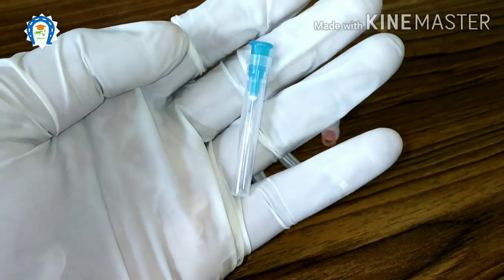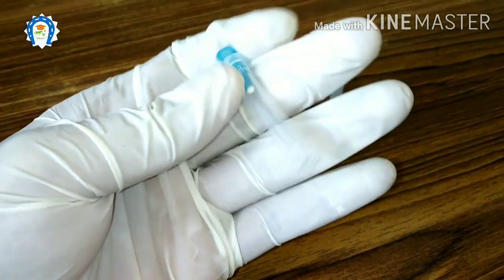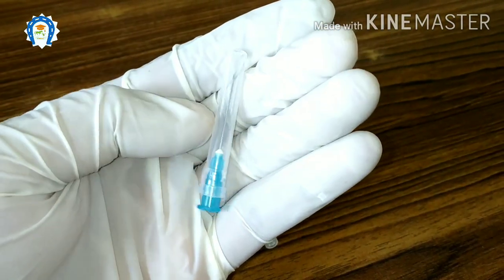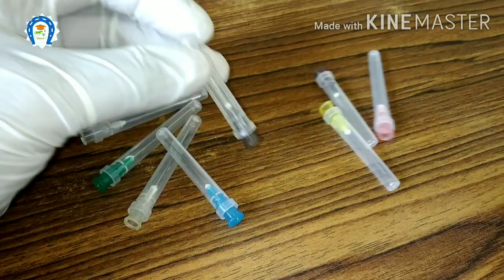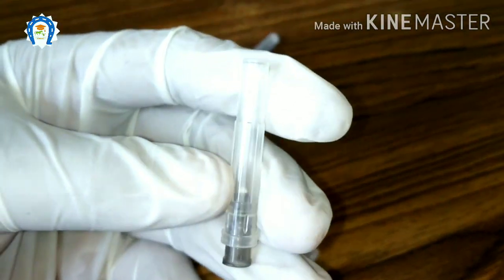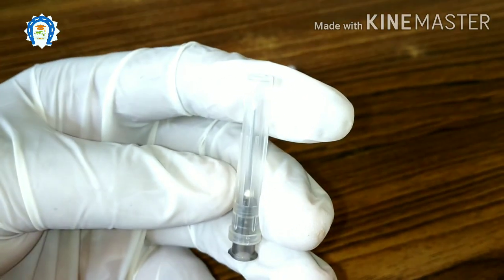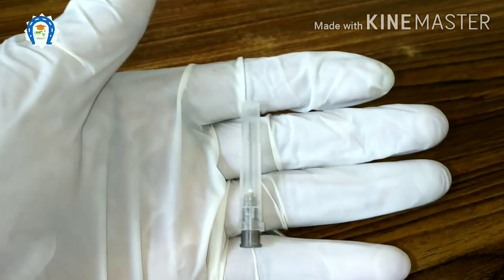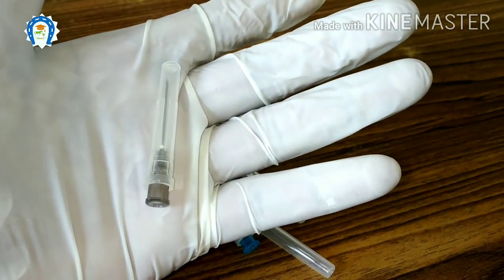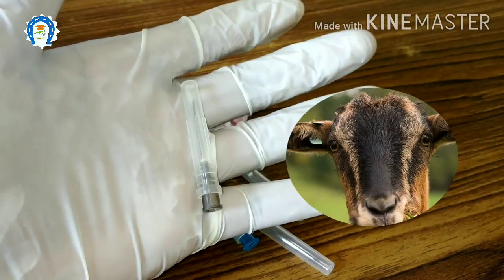This is the 23 gauge needle. We can use this for bigger dogs and kids. This is the 22 gauge needle that is black in color. We commonly use this in our small animal practice as well as large animal practice. This can be used for blood collection in dogs, goats, and kids, and intramuscular injections can also be given to dogs.